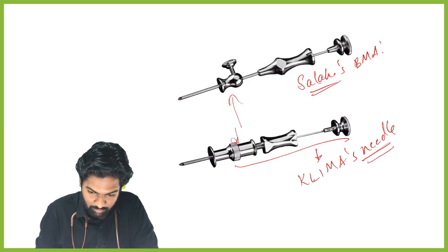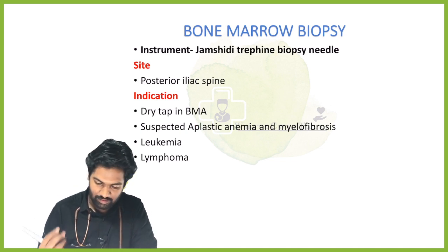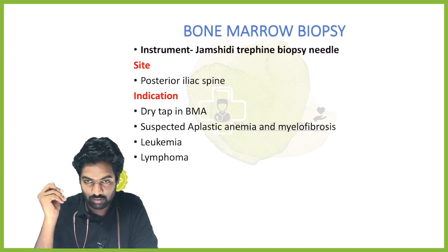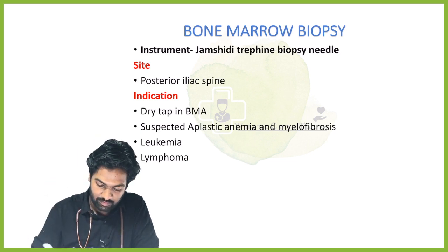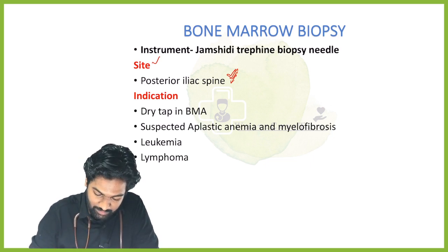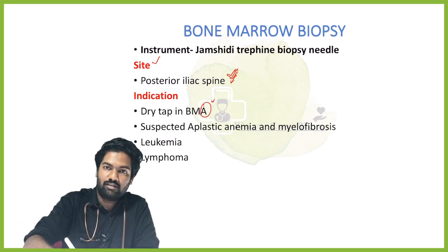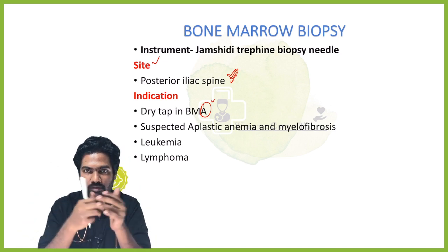Now we have come here. The next instrument we are seeing is the bone marrow biopsy needle. The instrument is named Jamshidi's biopsy needle. I'll show you how it looks, and you can differentiate between the aspiration needle and this. The site where you do bone marrow biopsy is the posterior iliac spine. And why you do it: if I am having a dry tap in bone marrow aspiration, I want to have a cut through and through, a good chunk of that bone and the entire marrow, and then I want to see that.